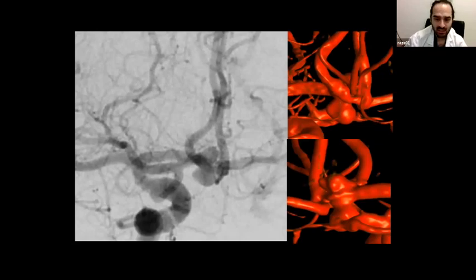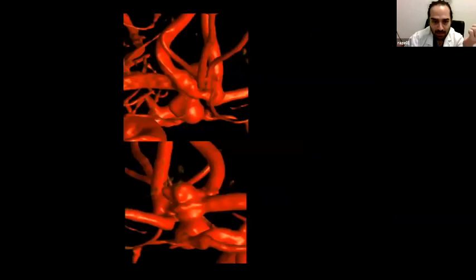It's very hard to understand with a 3D exactly what's going on. Yes, obviously there's an aneurysm, seems bilobed, there's an ACOM. And this is the role of this sort of imaging. You can get much more detail by applying this protocol.